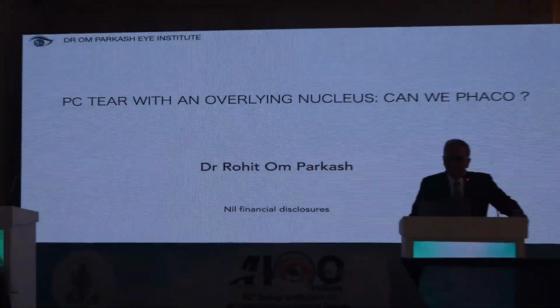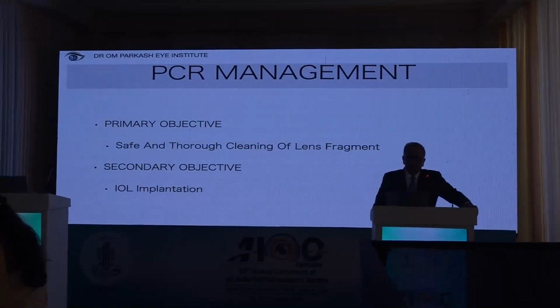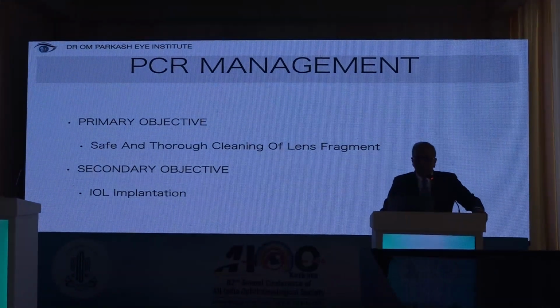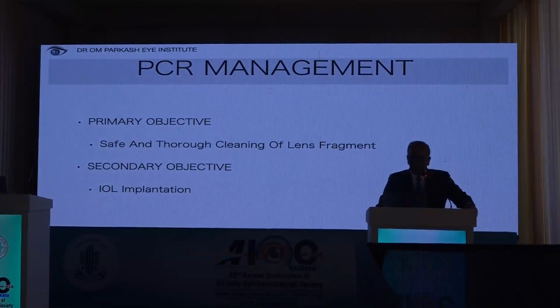Can it be phaco? This was what was asked by Dr. Deepak for me to speak about. Well, the primary objective when we have a PCR is to have a safe and thorough cleaning of lens fragments. And the secondary objective is to do an IOL implantation.